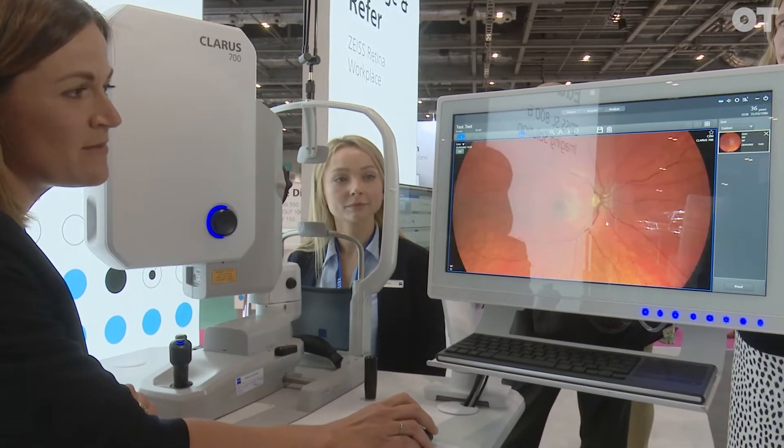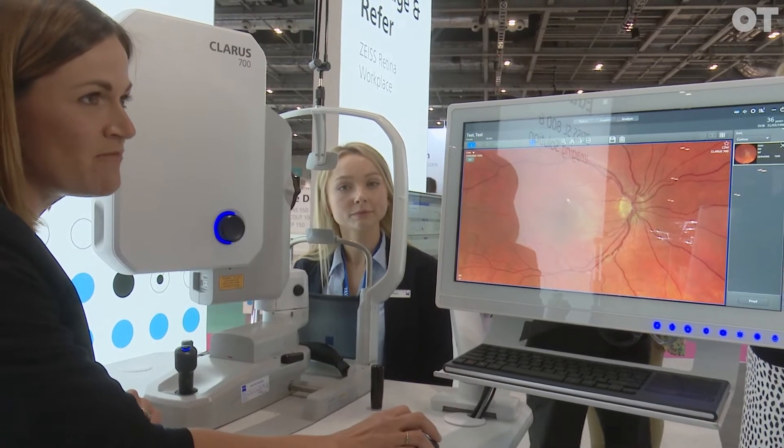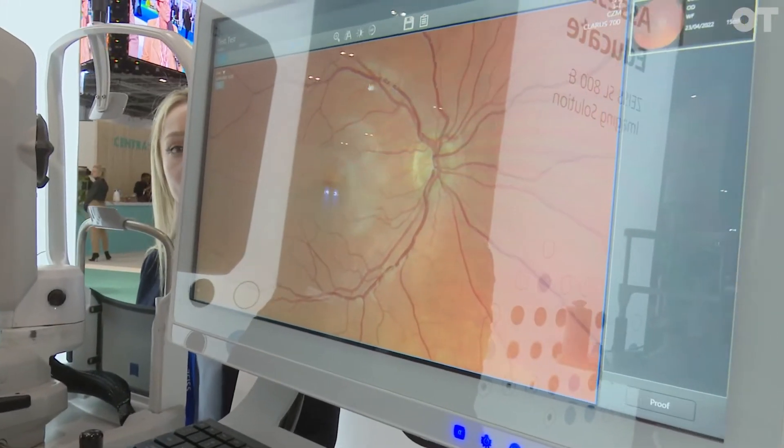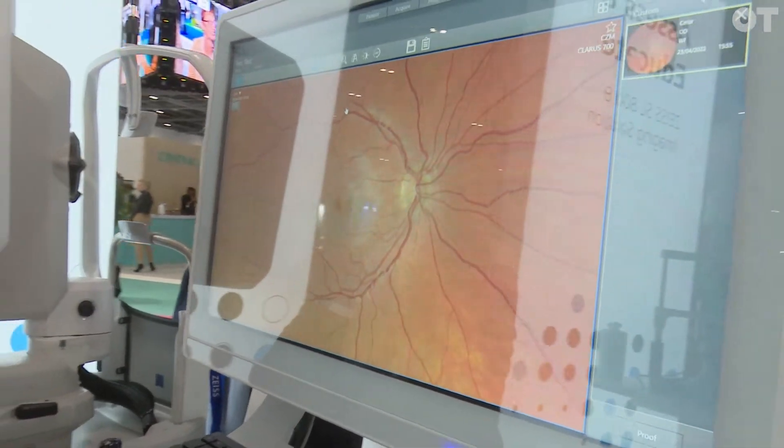Going into the analysis, we can see this nice image. We can zoom in and it's very high resolution — you can zoom right in on the macula and also the optic nerve head. You can see all the blood vessels. The beauty of this camera is it is true color, so it's the color you would see if you're examining a patient with a slit lamp.